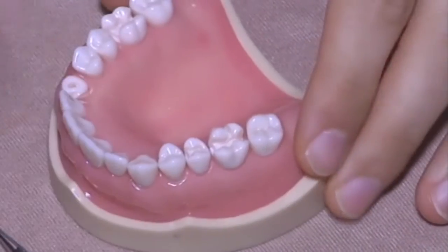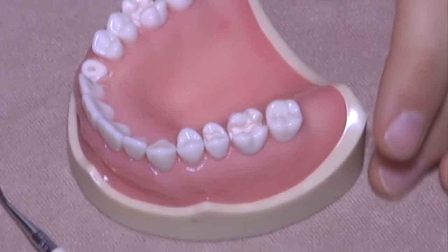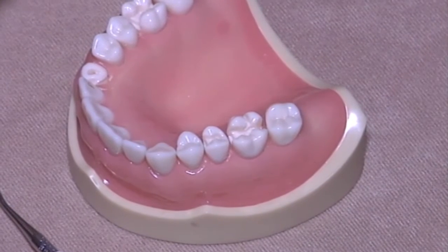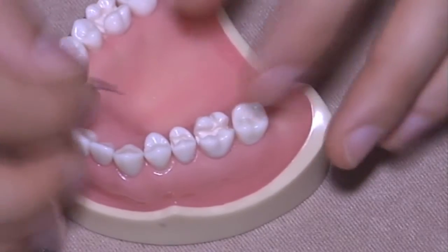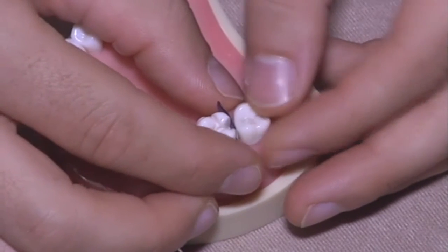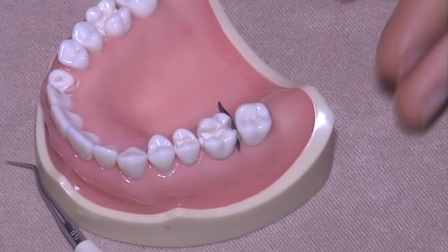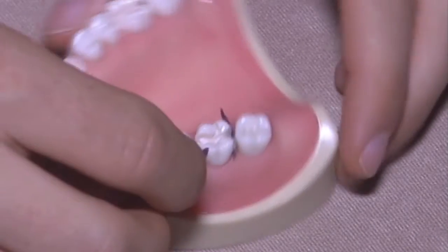Okay. So first of all, we have to place the interproximal matrix in order to obtain tight contact points, but in order to work as much more efficiently as you can, I used to apply all the matrices immediately.